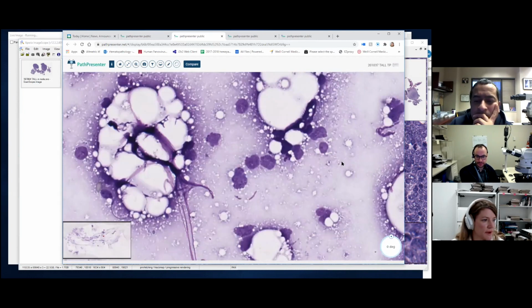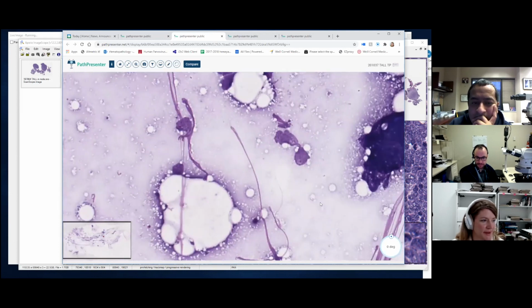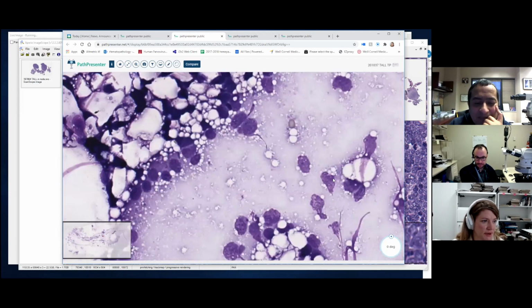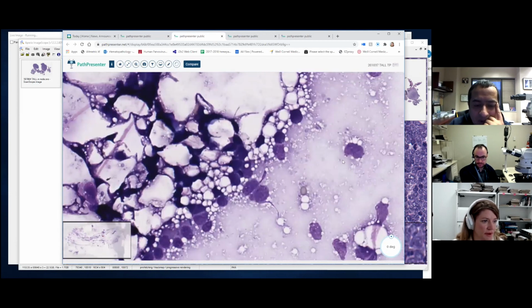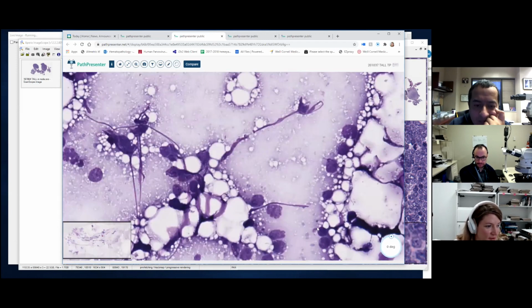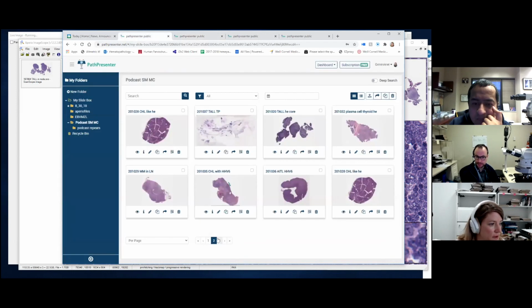Nice. Touch, yeah, they're kind of a little bit weird looking, but you can tell that doesn't look like CLL. Those things have a very fine chromatin on them, and it makes it a little bit easier to see. Some have a few little vacuoles in the cytoplasm, kind of a more blastic look on these guys. Do you still do routinely touch preps on all the possible lymphoma cases?